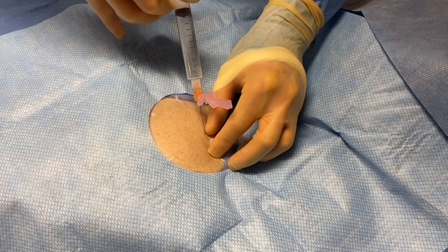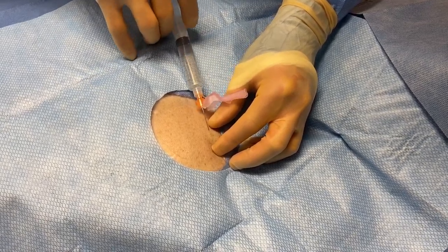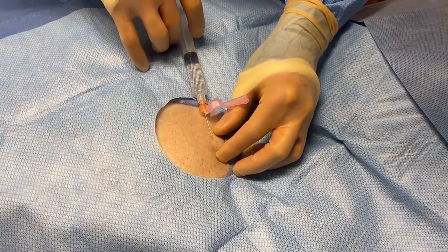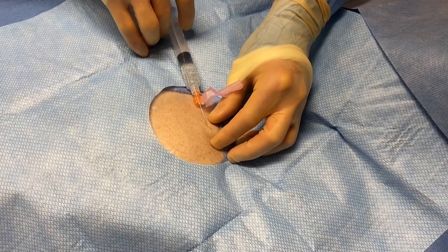There's a little prick. This is the numbing medication. We infiltrate lidocaine 1% copiously at the superficial level. The goal is to get the device to really straddle the heart very nicely.